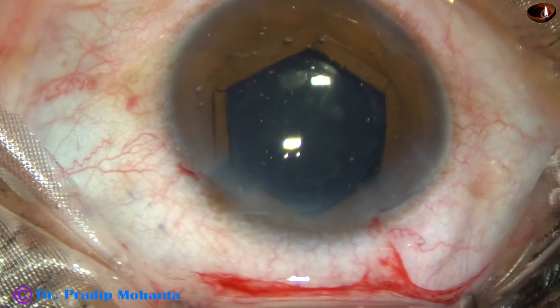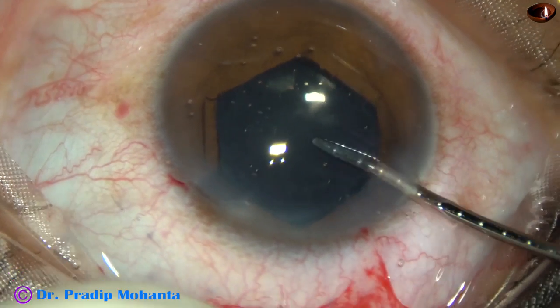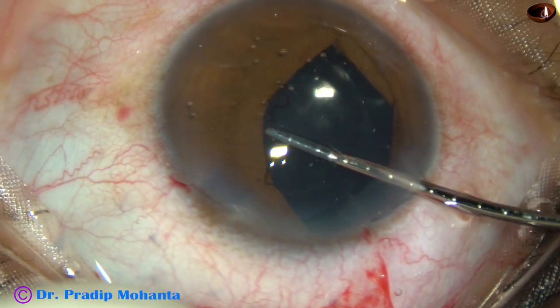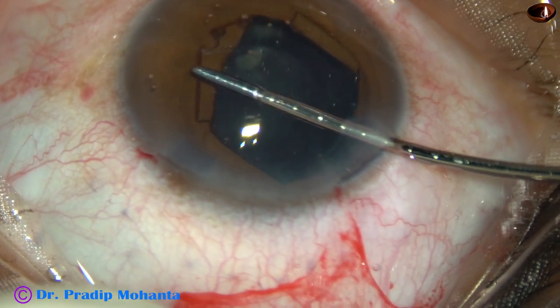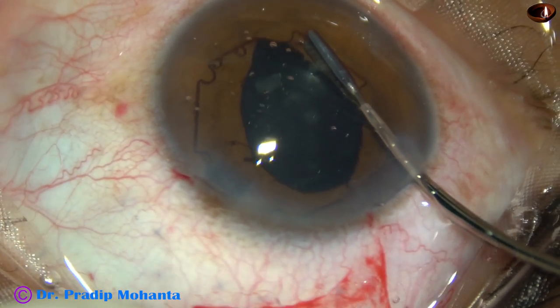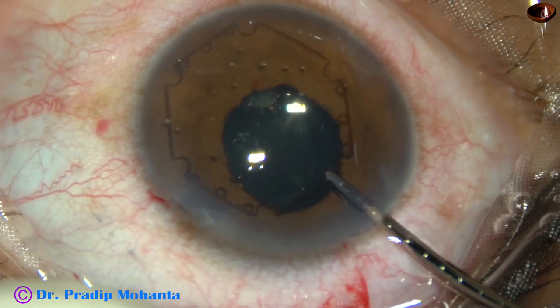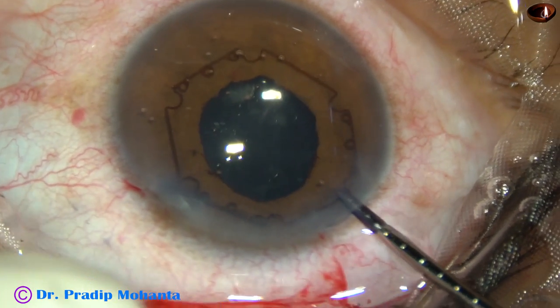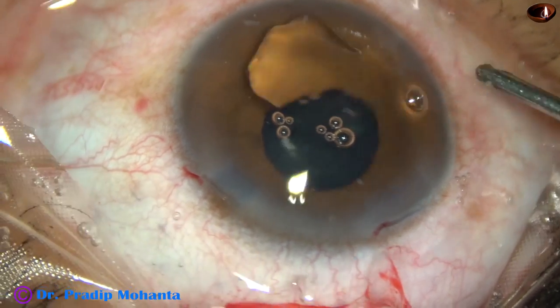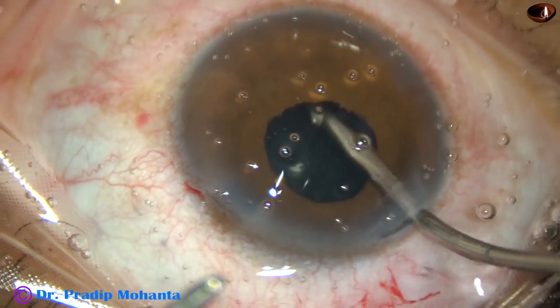By this time, the intraocular lens has been placed in the capsular bag. Now I'm going to remove the B-hex pupil expansion device — pull the device centrally, go up and then take it peripherally. If needed, hold the other flange above the iris, place the device over the iris and just pull it out. Removal of this device is simpler than its application.